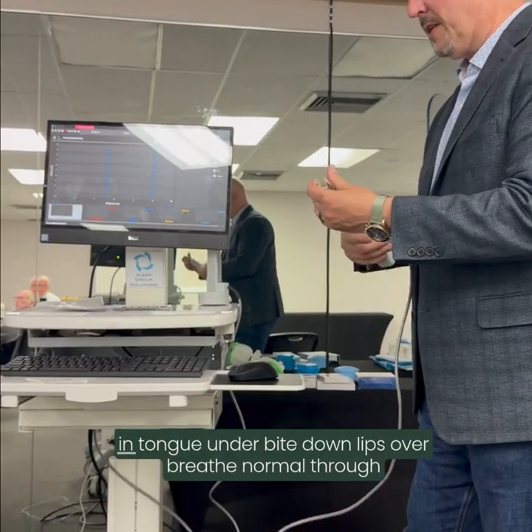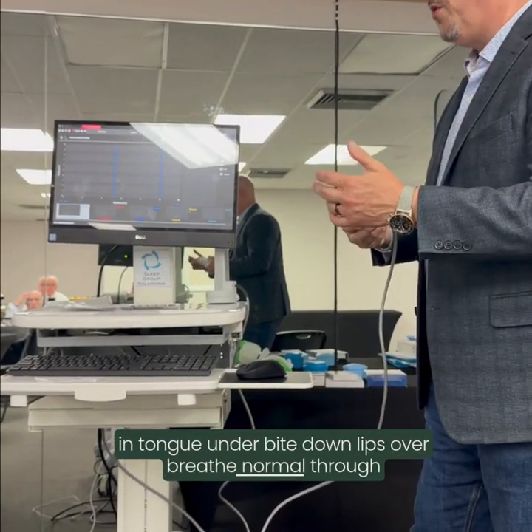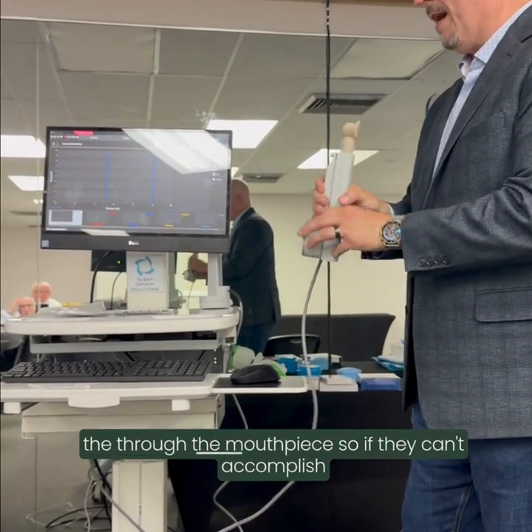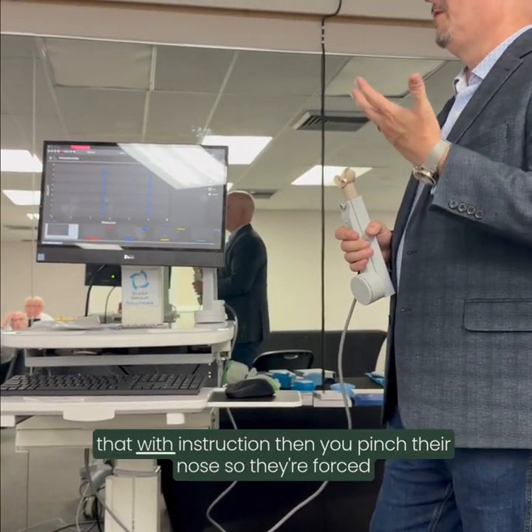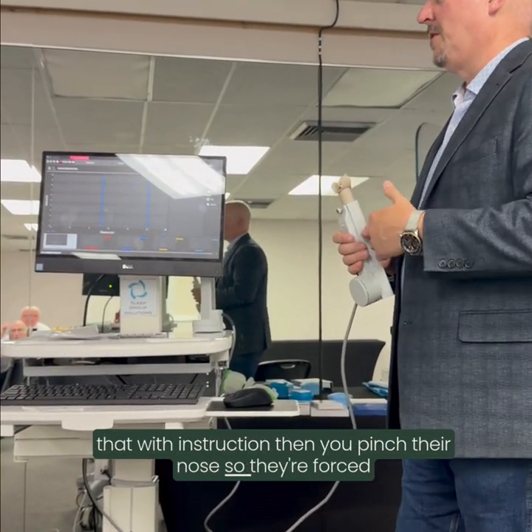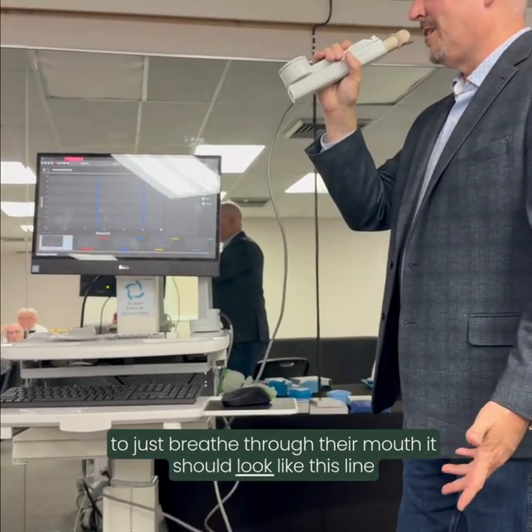The first test is real simple. They put the mouthpiece in, tongue under, bite down, lips over, and breathe normally through the mouthpiece. If they can't accomplish that with instruction, then you pinch their nose so they're forced to breathe through their mouth. It should look like this.